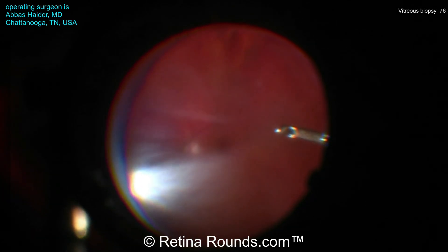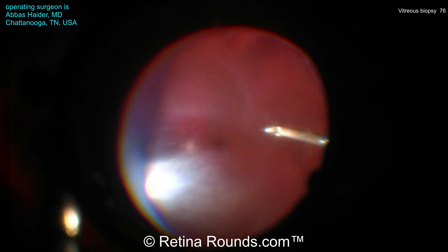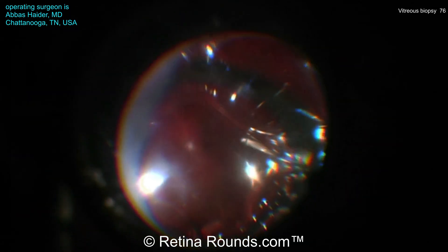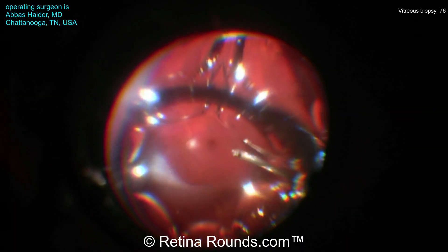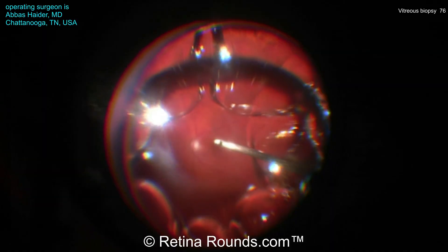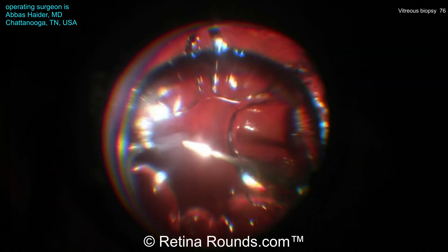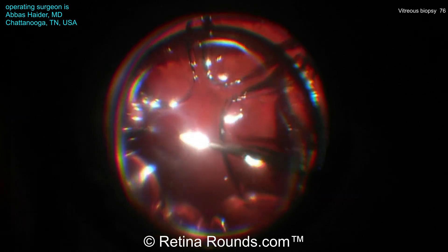Here we see the vitrectomy being performed. During the vitrectomy, air is being infused and the aspiration line of the vitrector is connected to a 5 to 10 cc syringe. Manual aspiration of the syringe drives the aspiration of the cutter. This can be done with an experienced assistant, or the surgeon can do it themselves by placing a chandelier and manually aspirating during the vitrectomy.